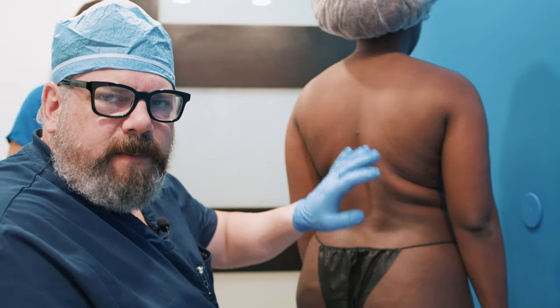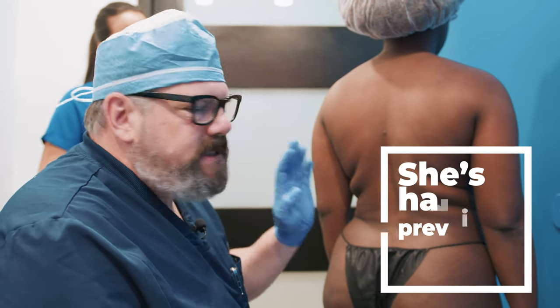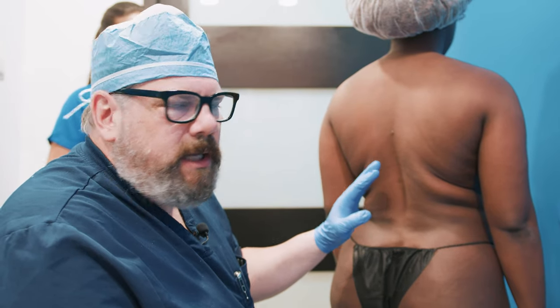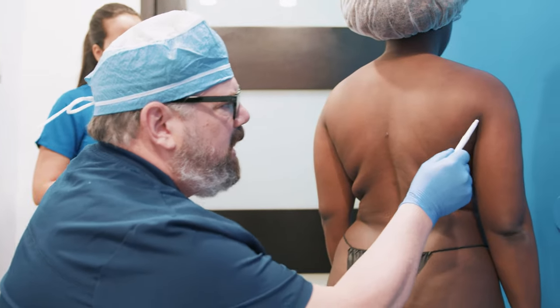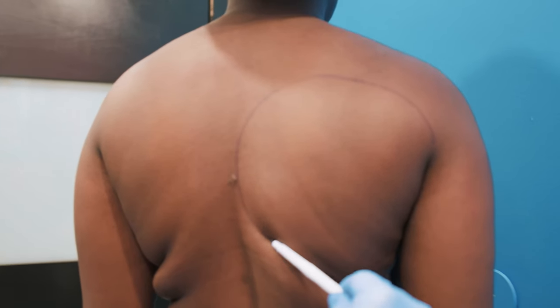I'm marking the patient here for a lipo, and I thought it'd be a good time to explain. She's had previous lipo before, and she wanted lipo again. I asked why, and she said her upper back was not adequately lipoed — it probably was not particularly lipoed much at all.